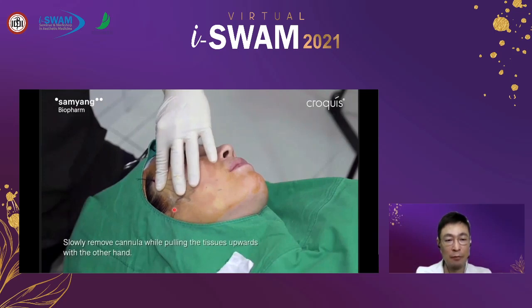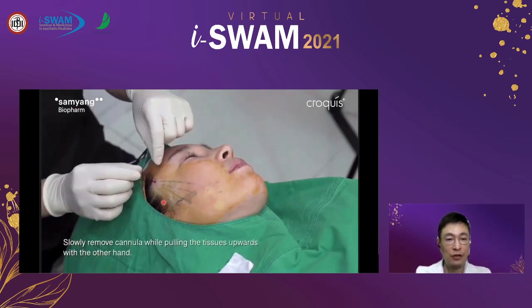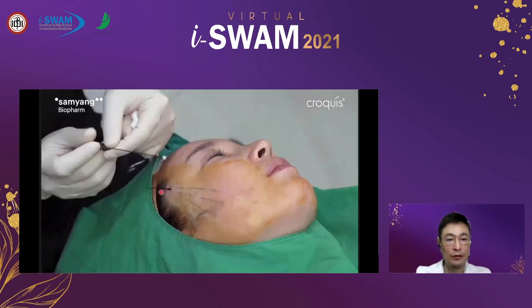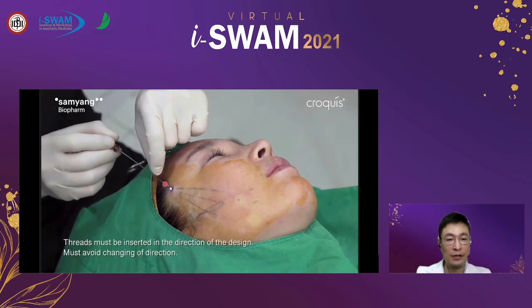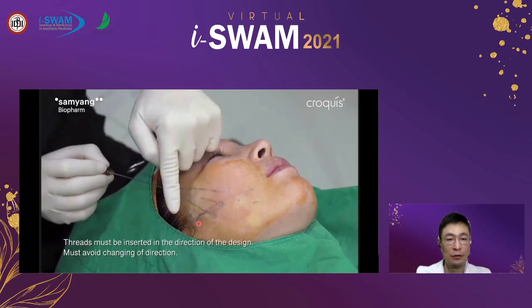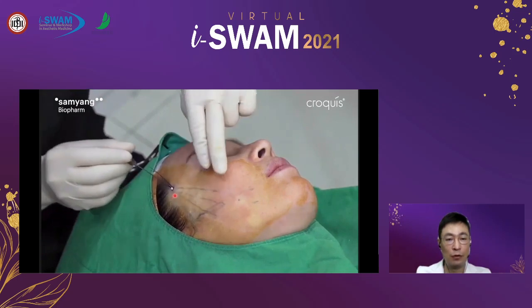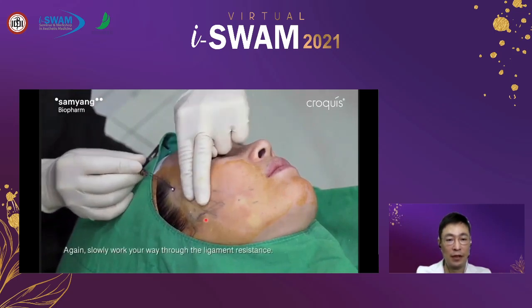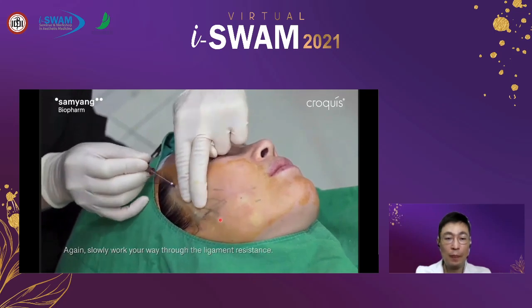Severe bleeding may happen. And after removing the cannula, I usually tie two knots using two threads. Before tying, put more threads as designed.